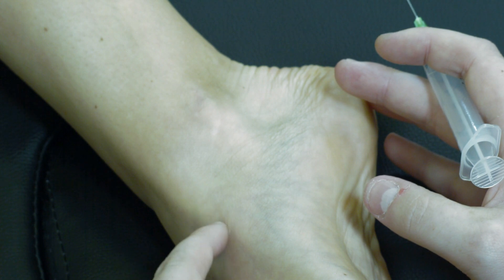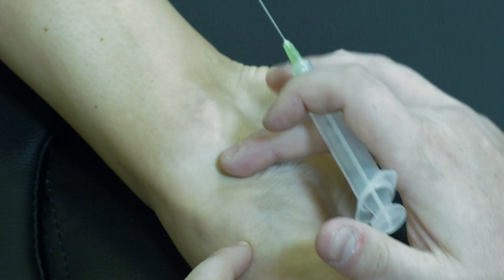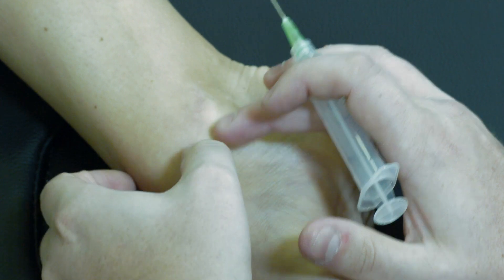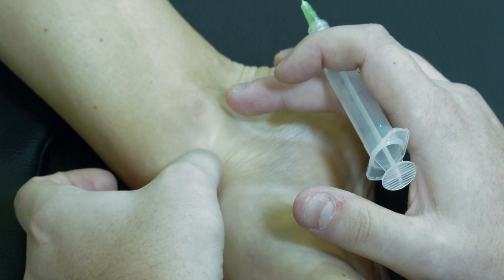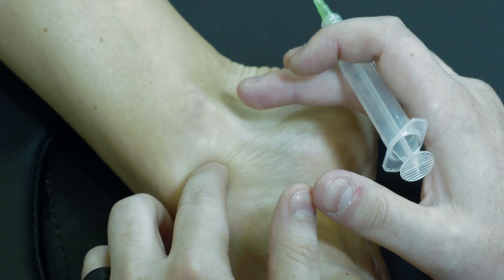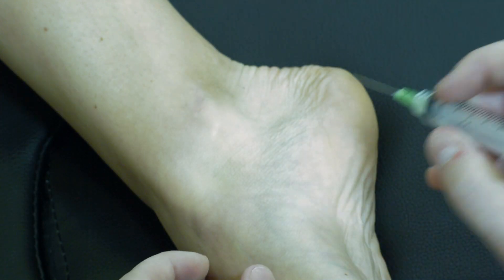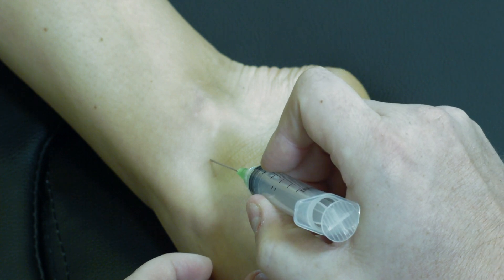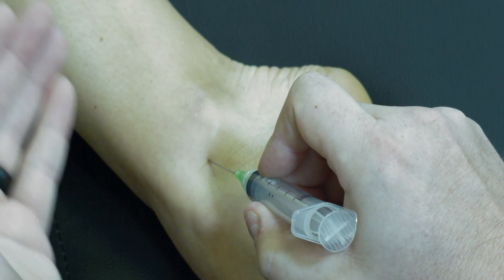We have the anterior tibialis tendon running anteriorly, and we're going to stay medial to that. We'll be just distal to the tip of the medial malleolus, and within that divot on the side of the ankle you can feel the edge of the talus dome — we're going to come in just superior to that. Clean in your usual fashion, then place the needle at about a 45 degree angle to the skin, angling both proximally and posteriorly.